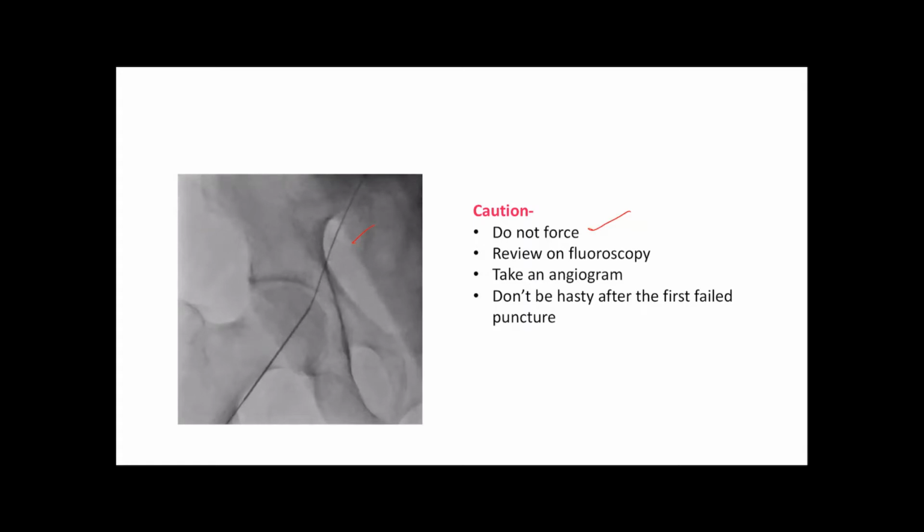So as I said, if there is any issue, you should take an angiogram and you should not be hasty. And even if you have a failed puncture, it's important that you give a gap before the second puncture.